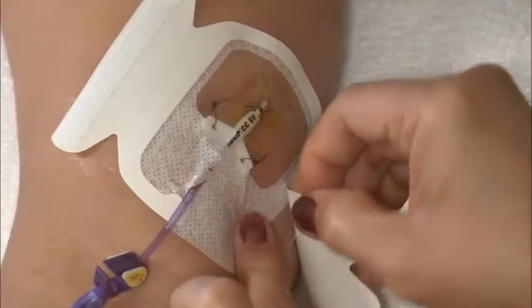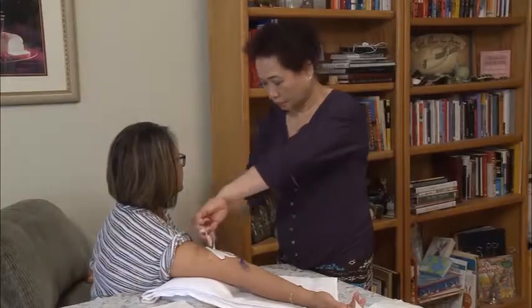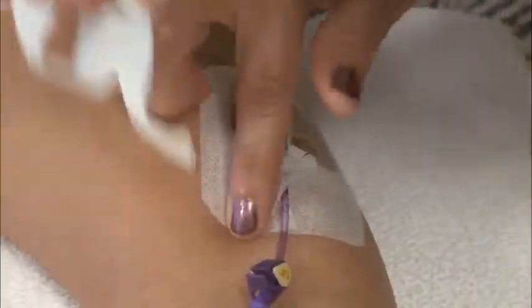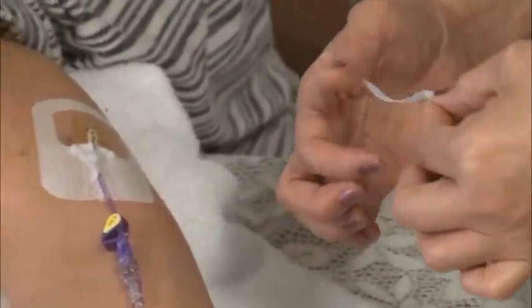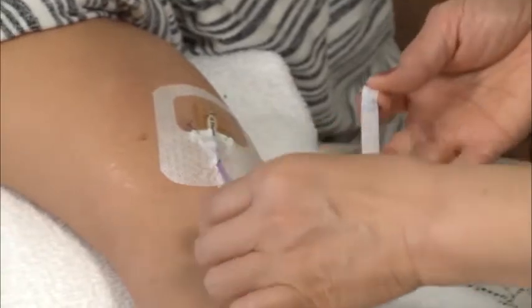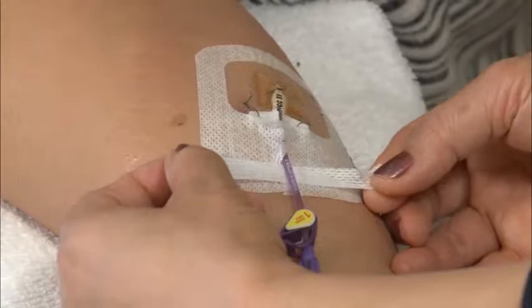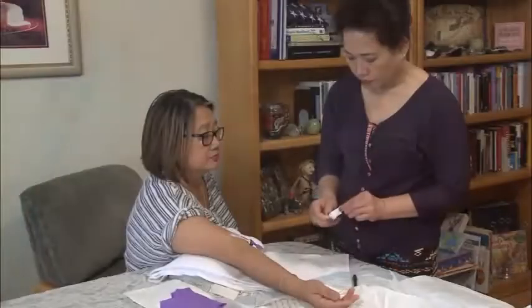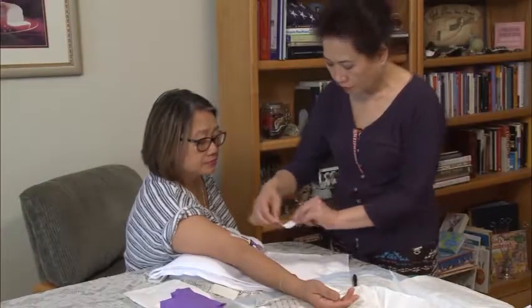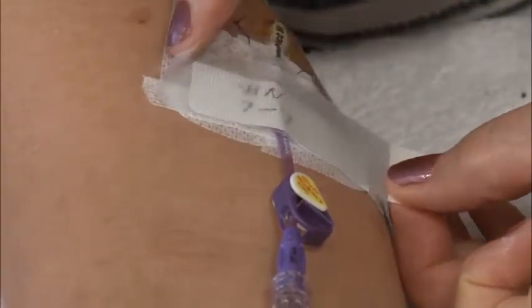Continue peeling the paper off and pressing down the edges of the dressing. Secure the lower edge of the dressing with a strip of tape. Slip this tape up under the catheter extension and slightly overlap the dressing. Press down onto the dressing. Write the date and your initials on the label provided. Place along the lower edge of your dressing and cover it with a strip of clear plastic tape.